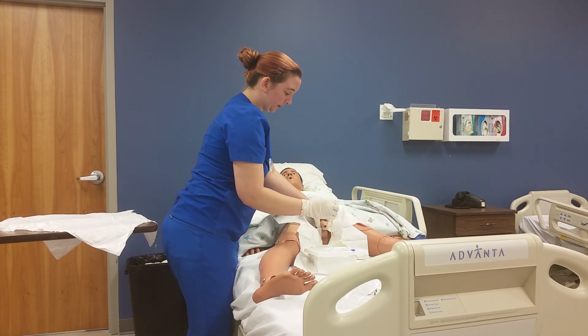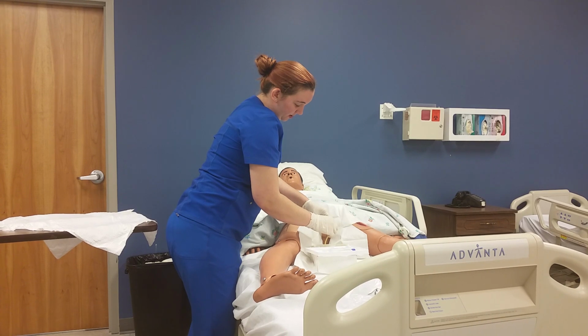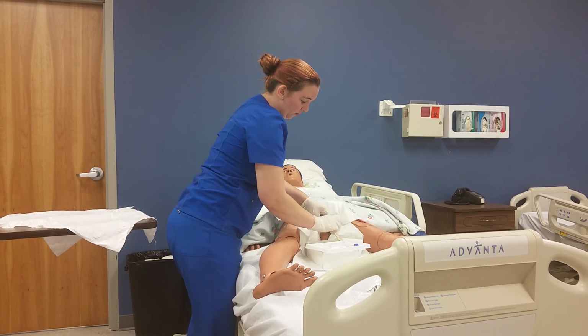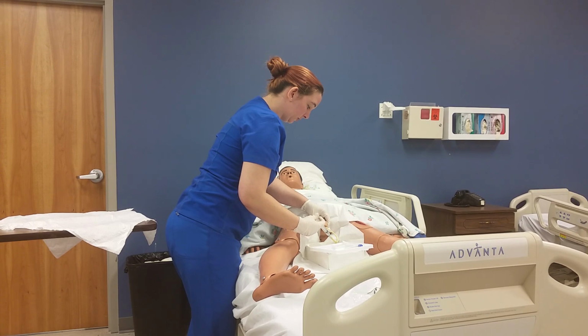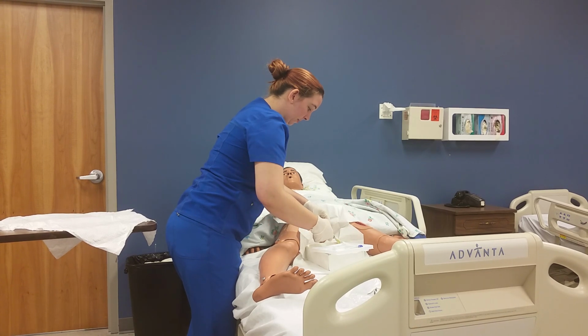My tube has got lubrication on it already. I'm going to have him take a deep breath and try to relax. And I'm going to place the catheter in 6 to 9 inches, or until I see urine return. Once I see urine return, I'm going to go in 1 more inch, and then fill it up with water or normal saline. This is going to keep our balloon in place.